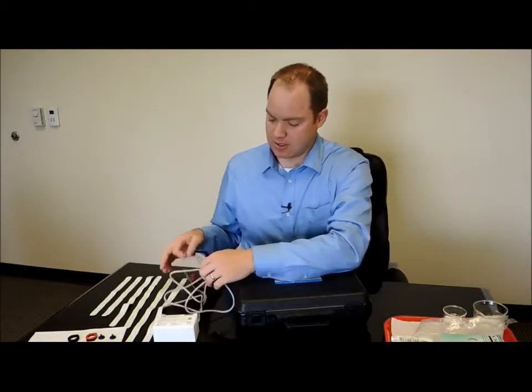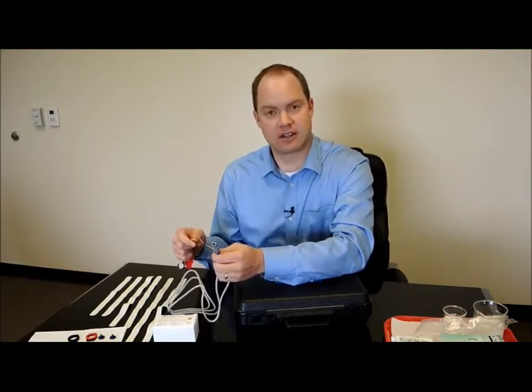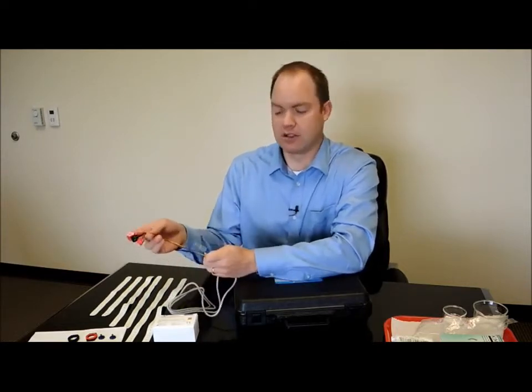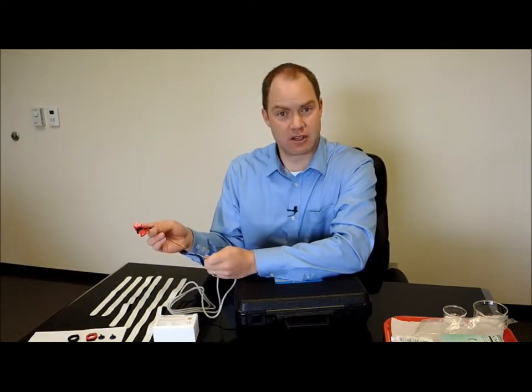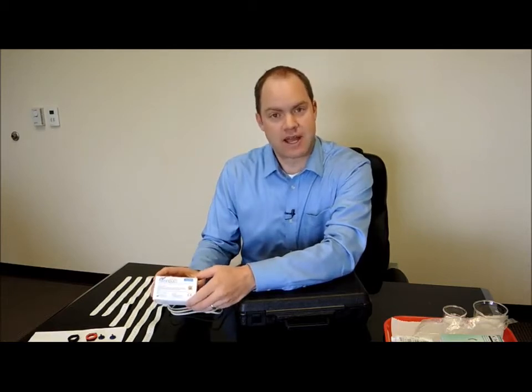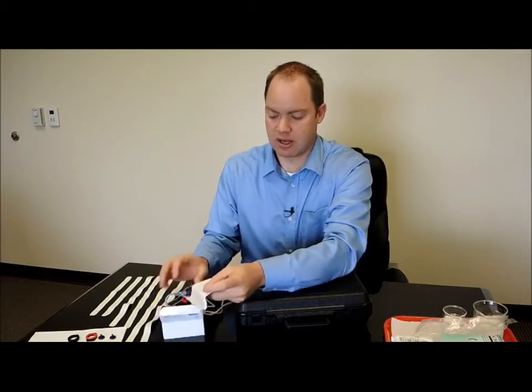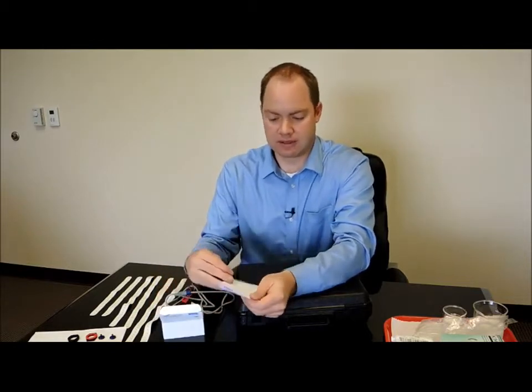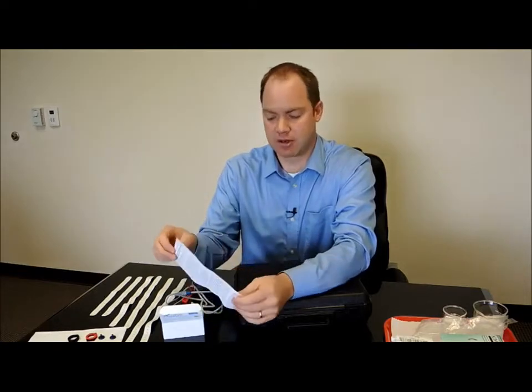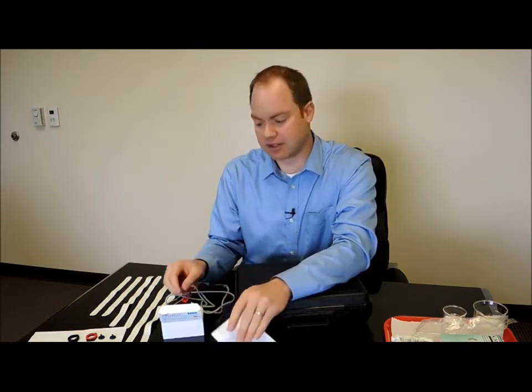Some of the accessories that come with the Nanoduct is the electrode cable. This is the cable that will be attached to the Nanoduct instrument on one end and to the patient on the other end, and we'll show you how to use that in a little bit. This is the supply kit. In this kit there are instructions to the parent, just a minor risk about some burns, and some instructions for you to follow as the technician on how to properly perform a sweat test with the Nanoduct.